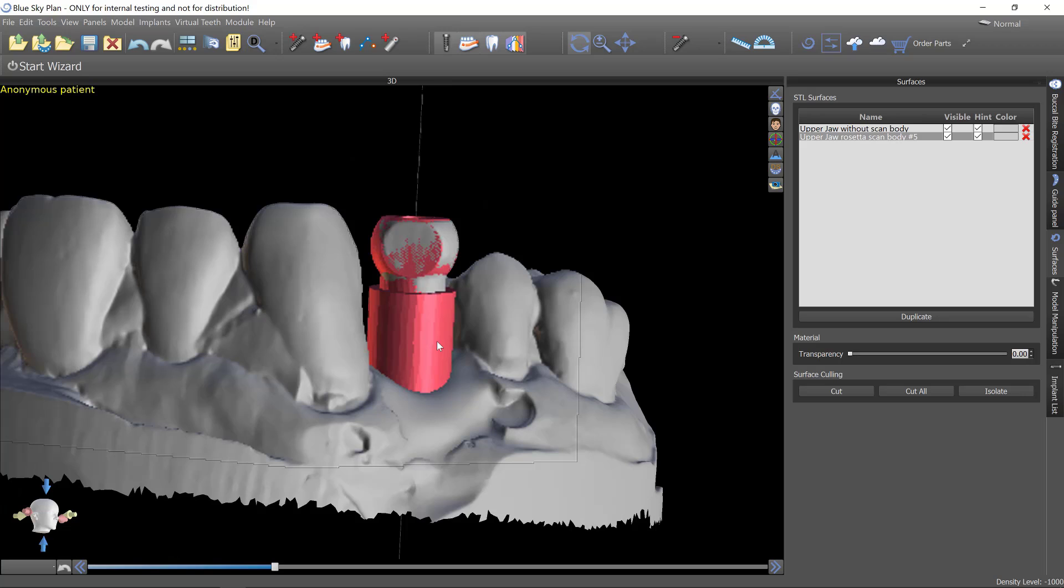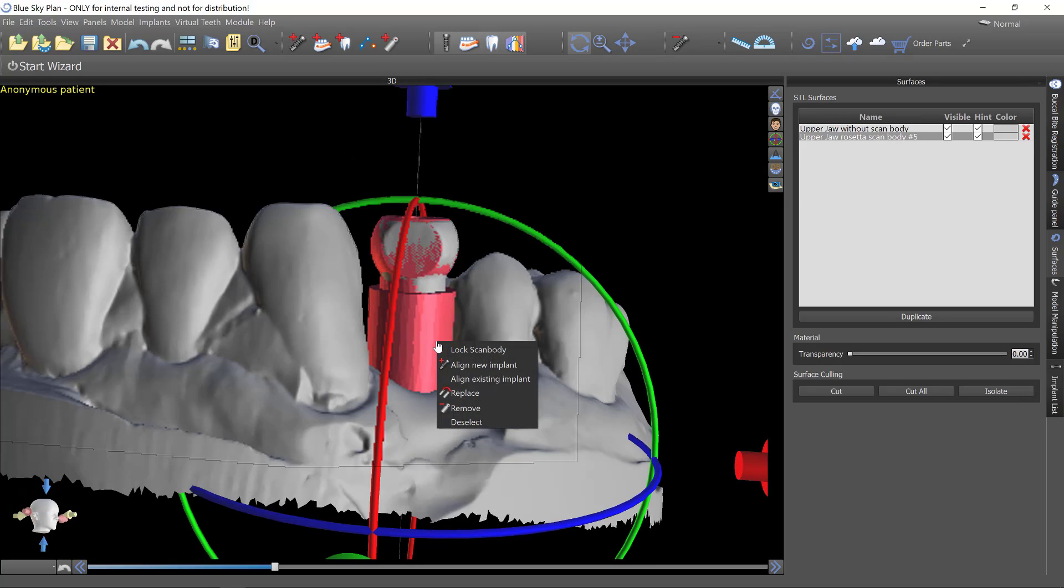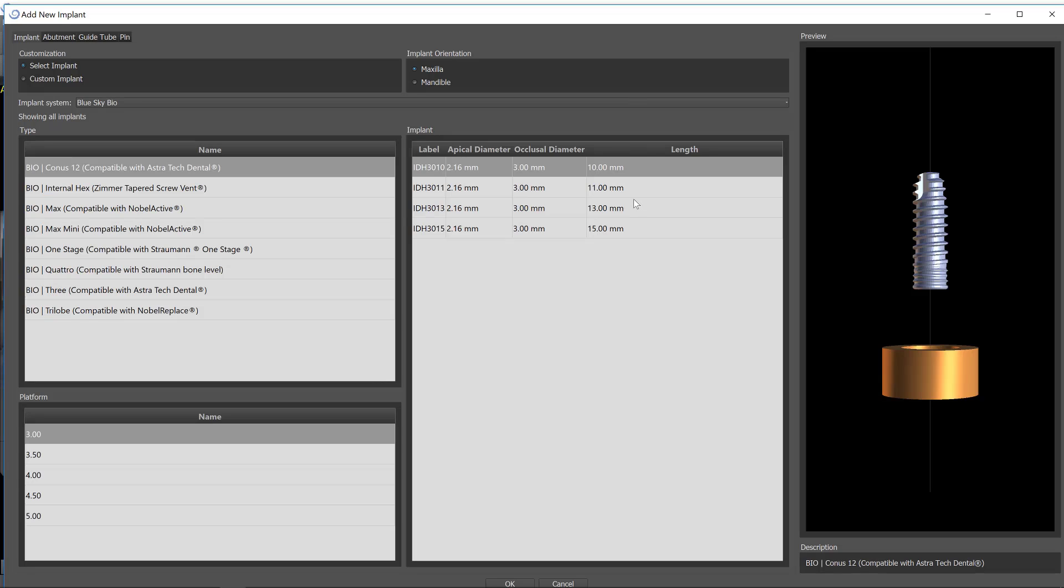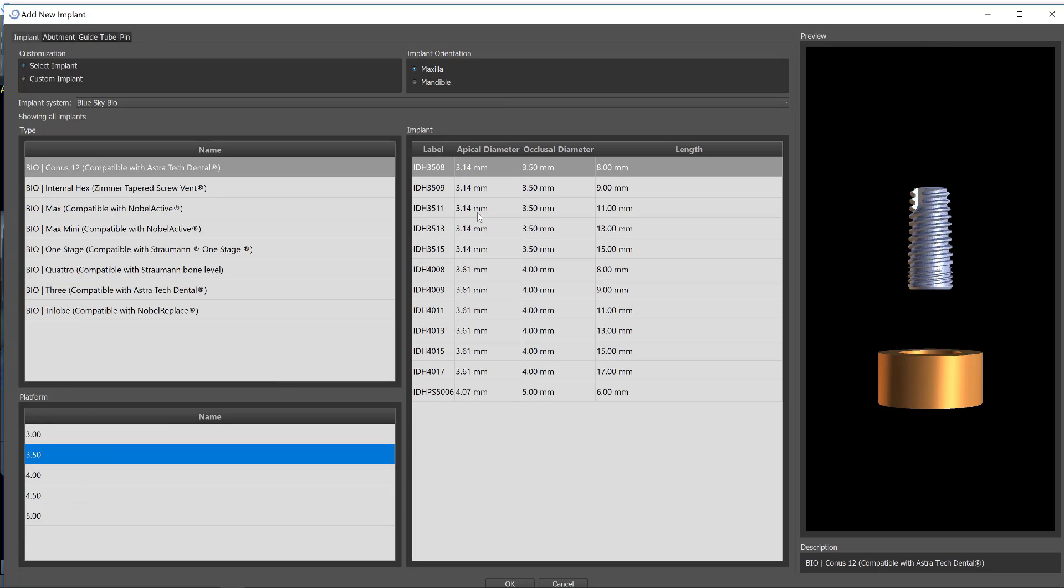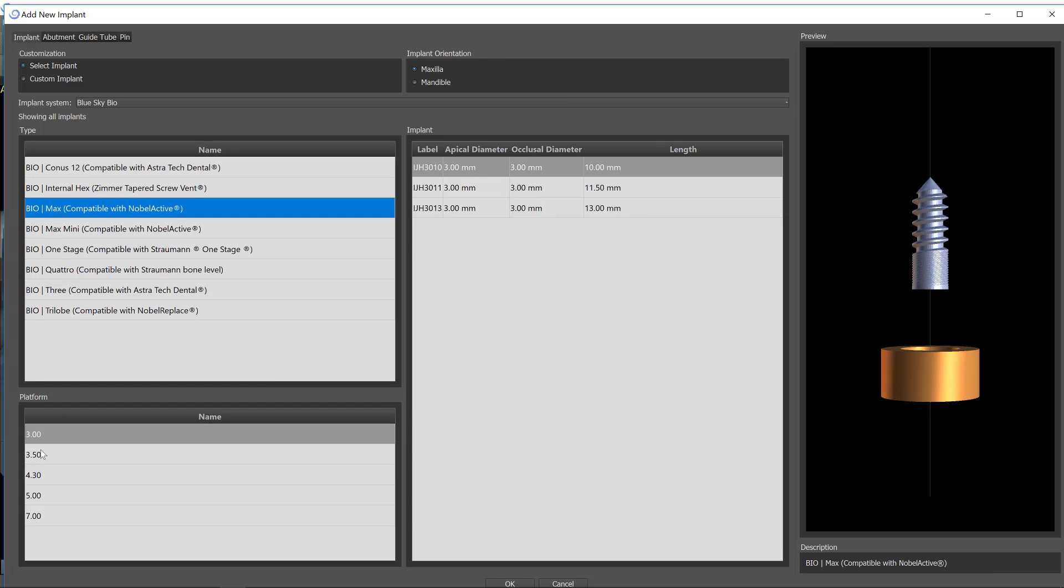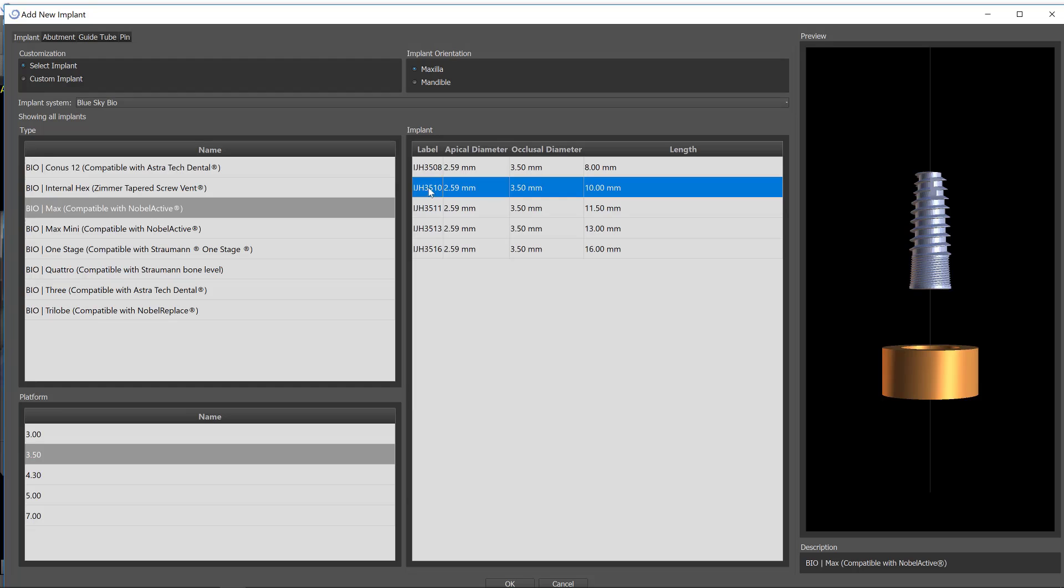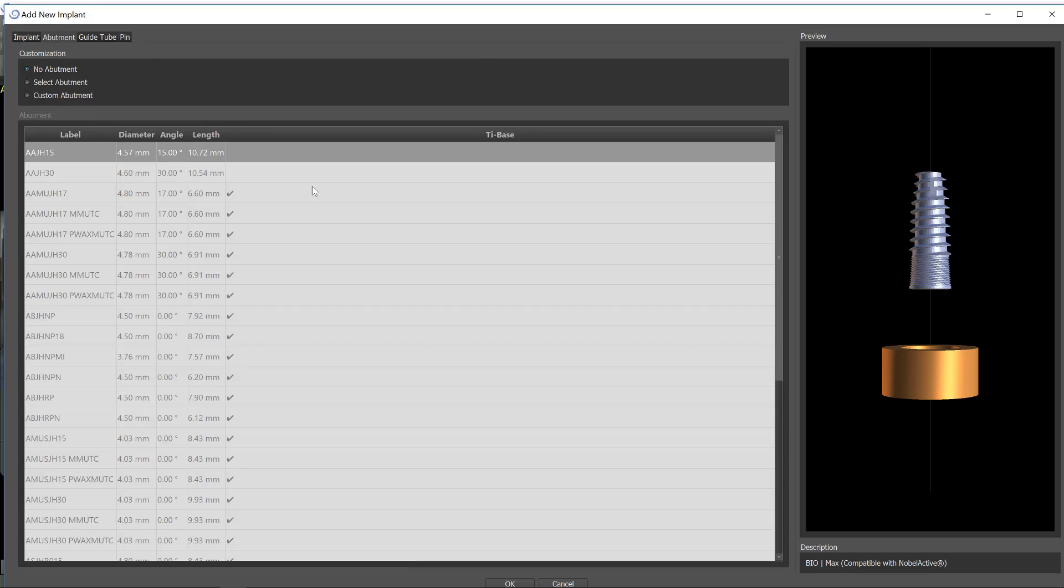Now what you can do is right click this and say align an implant. Let's say that I originally did a BioMax 3.5 by 10 millimeter implant. I would go up here and select that. BioMax 3.5 by 10 millimeter length in the maxilla.